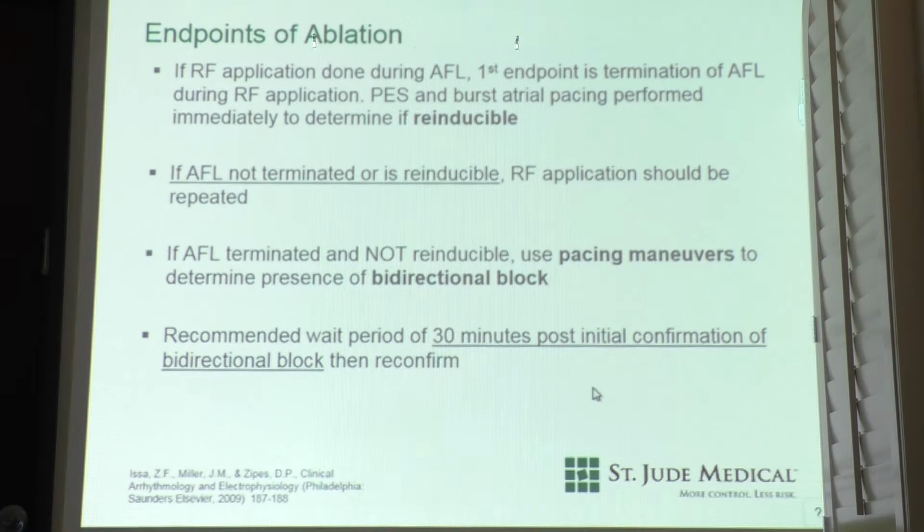Which is why you usually test continuously. So you'll pace the entire time of that 30 minutes and make sure they don't come back. Because then the moment they reconnect, you'll know when you can come back on, rather than wasting maybe 10 minutes you didn't know.